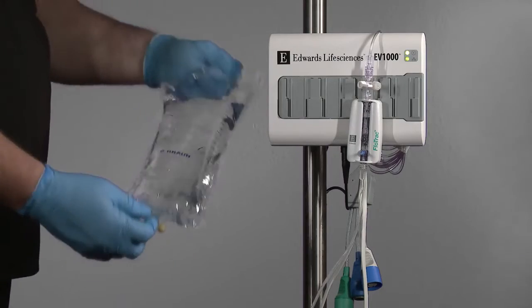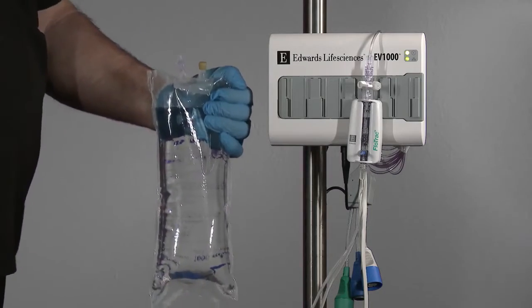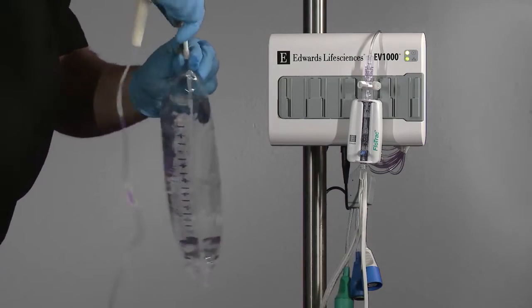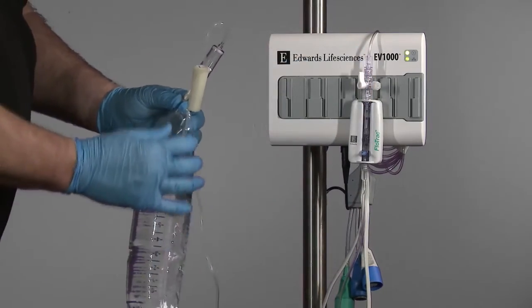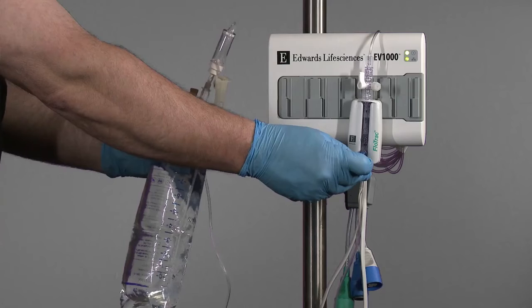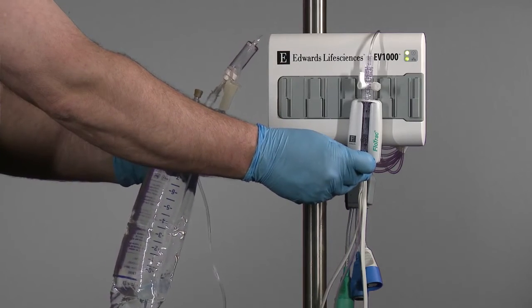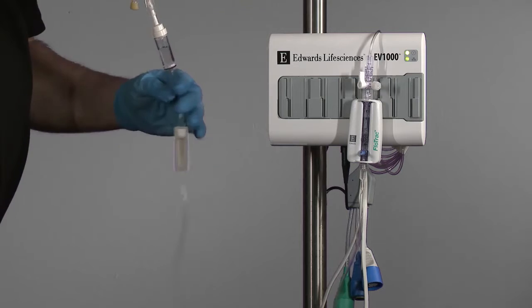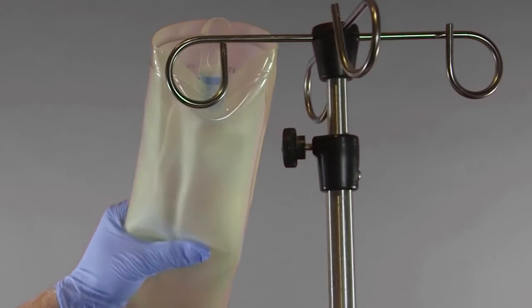Invert the flush bag, allowing air to rise to the base of the bag. Spike the flush bag with the fluid administration set. Turn the FlowTrack sensor stopcock toward the pressure tubing. While keeping the bag inverted, place pressure on the bag with one hand while pulling the flush tab on the sensor to evacuate air from the bag and fill the drip chamber halfway or full depending upon institutional preference. Insert the flush bag into the pressure infuser bag and hang on the IV pole, but do not inflate the infuser bag.